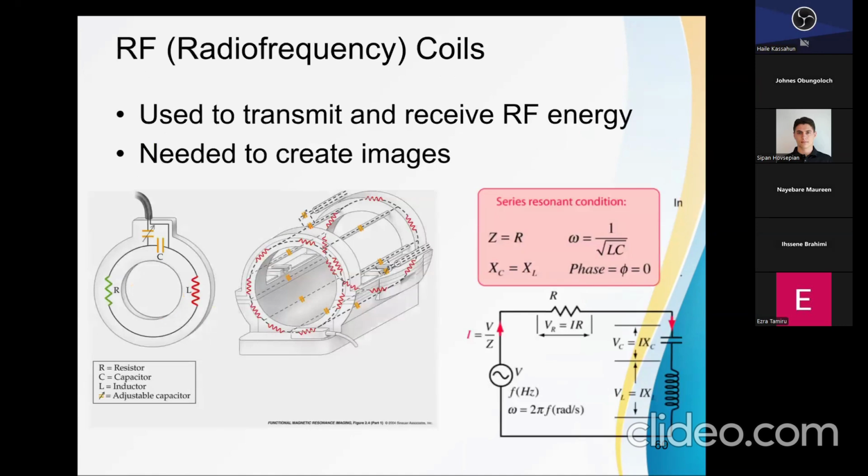And many of these circuits are what we call LRC circuits. You need an oscillator, and these are provided mostly by capacitors, okay, and inductors and resistors. So as you are building your coil, you inadvertently have resistance embedded in there, because the coil has resistance.